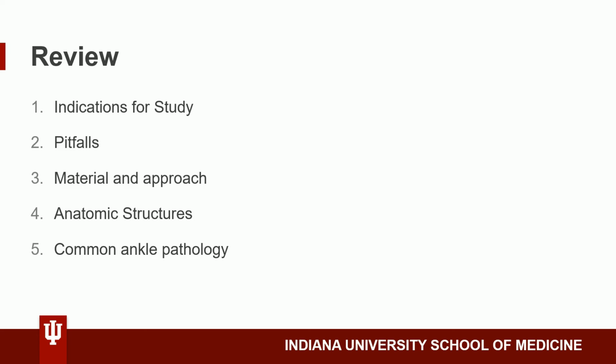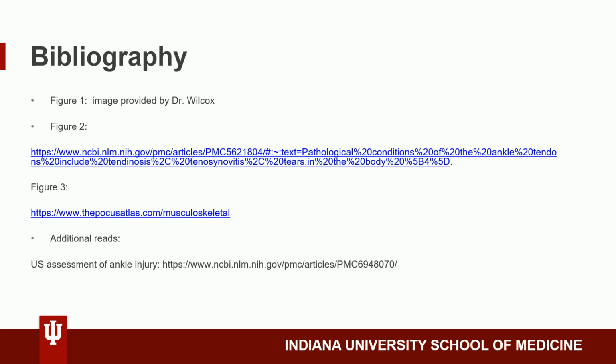To recap, we have reviewed indications for an ankle ultrasound, pitfalls, materials and approach, anatomic structures, and common ankle pathologies. This concludes my presentation.